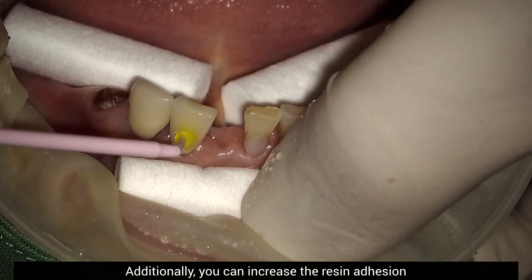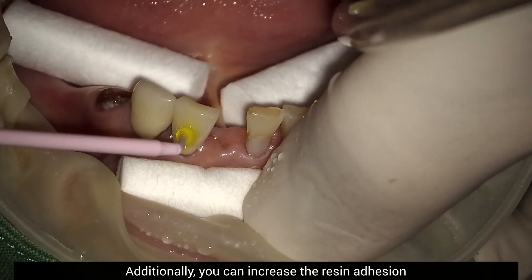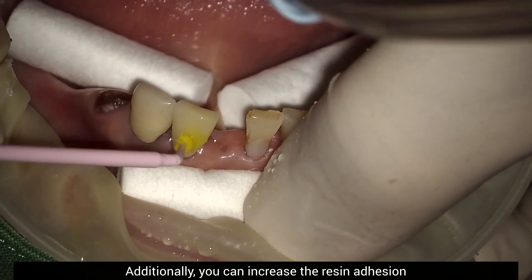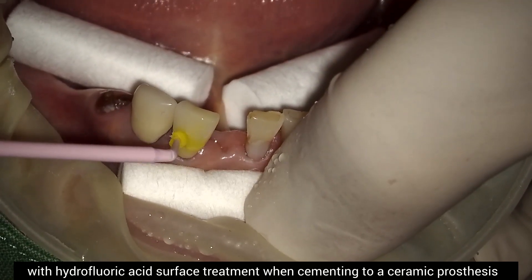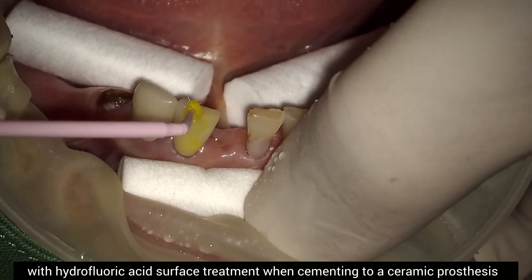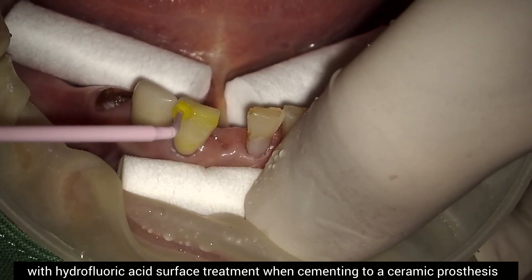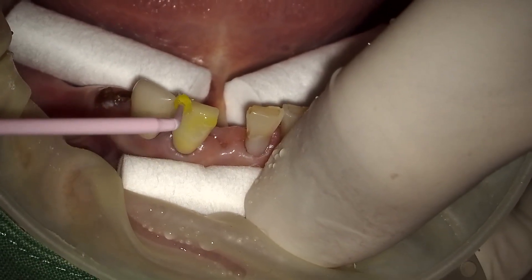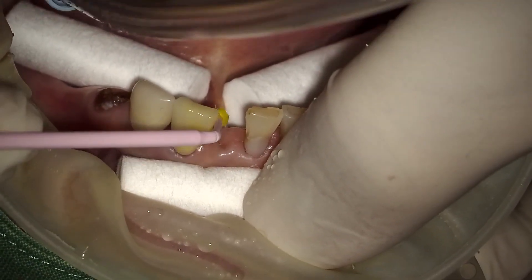Additionally, you can increase the resin adhesion with hydrofluoric acid surface treatment when cementing to a ceramic prosthesis.